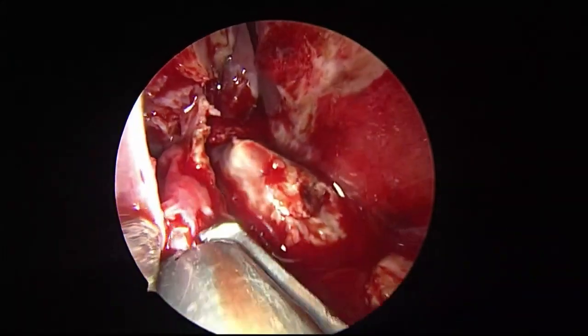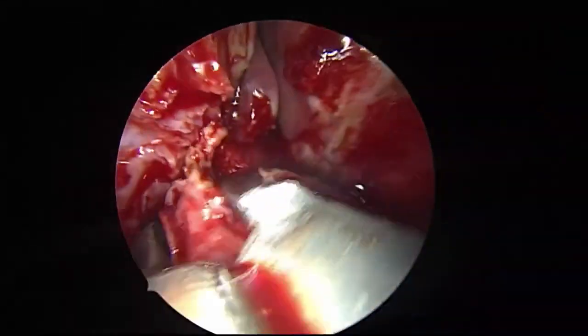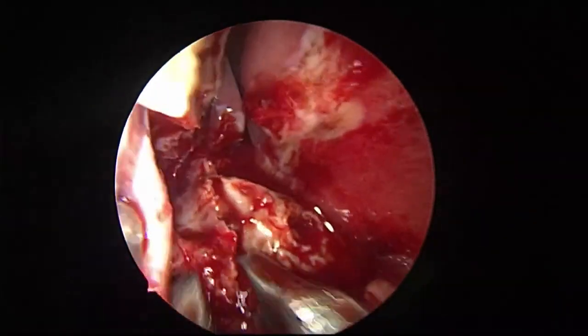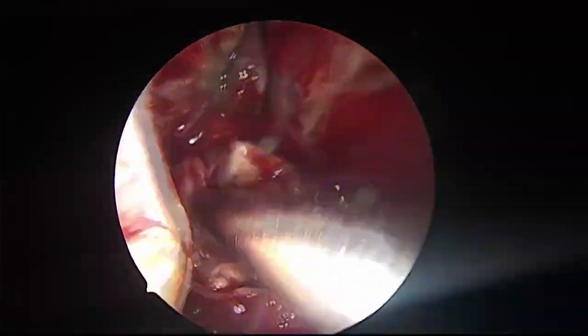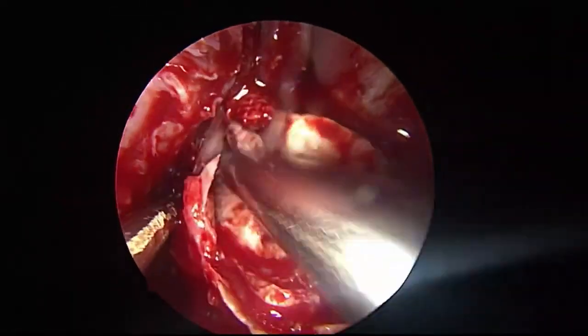This is the lateral wall, which is pushed. See this? That's the lateral wall. See how the tumor has pushed the lateral wall. This is the pushed lateral wall I'm dealing with.